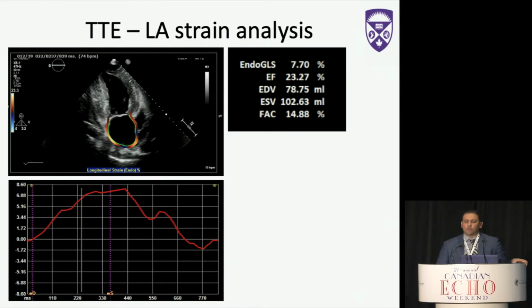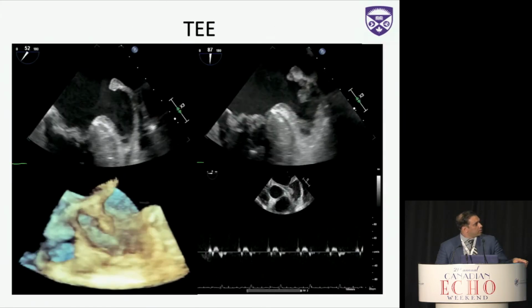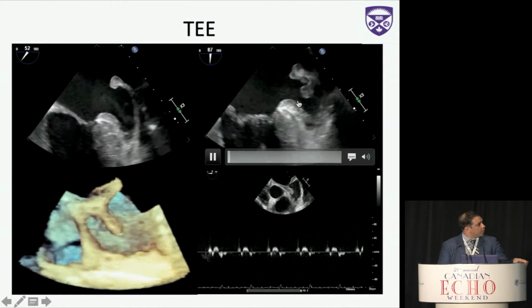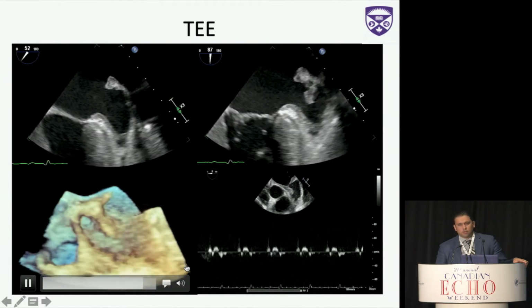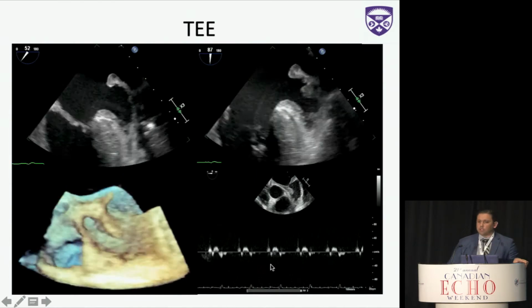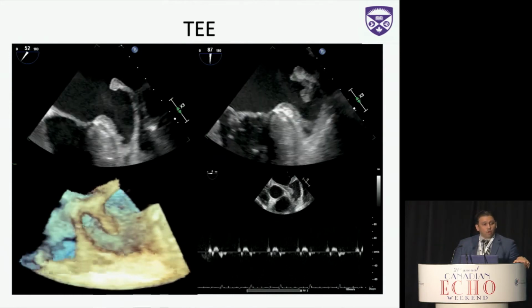But I pushed and pushed for a transesophageal echocardiogram, which usually it's the neurologist pushing for. They didn't think it was necessary and they discharged him. So I brought him in as an outpatient 4 days after his discharge from hospital, and here's his transesophageal echocardiogram. You can see that this is his left atrial appendage, and there's significant smoke and a fairly sizable left atrial appendage thrombus. Here we're looking at it from the back just because we can, and we see that thrombus on 3D. You notice that in sinus rhythm, he has markedly reduced left atrial appendage emptying velocities. So upon seeing this in his fresh stroke, I immediately anticoagulated him with a NOAC.